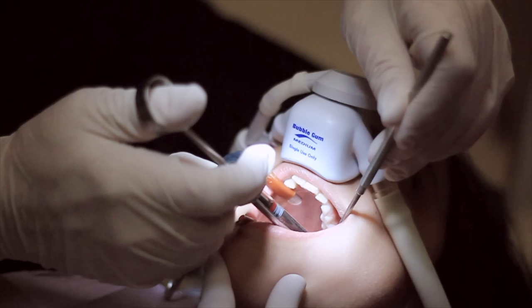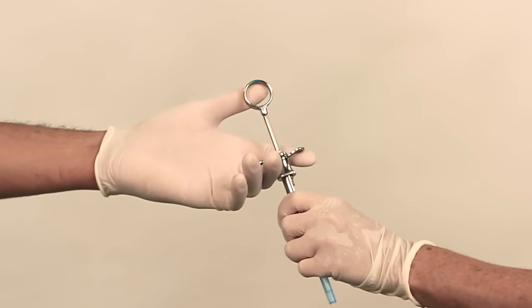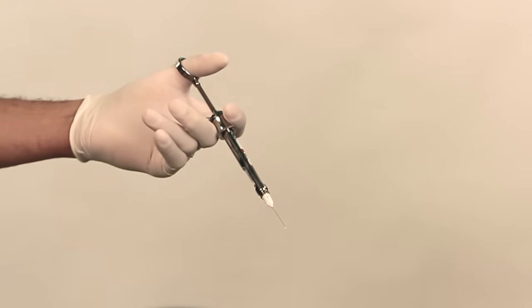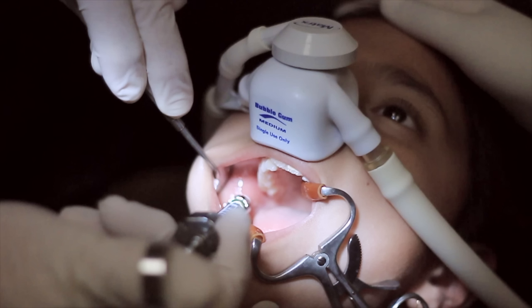If you are anesthetizing the entire mandibular arch, express half on the first side, also extruding while retracting from the mouth, and the other half of the carpule on the opposite side. Have the assistant pass and uncap a new syringe and return to the last area injected. Using the same technique, upload a full carpule at that site.